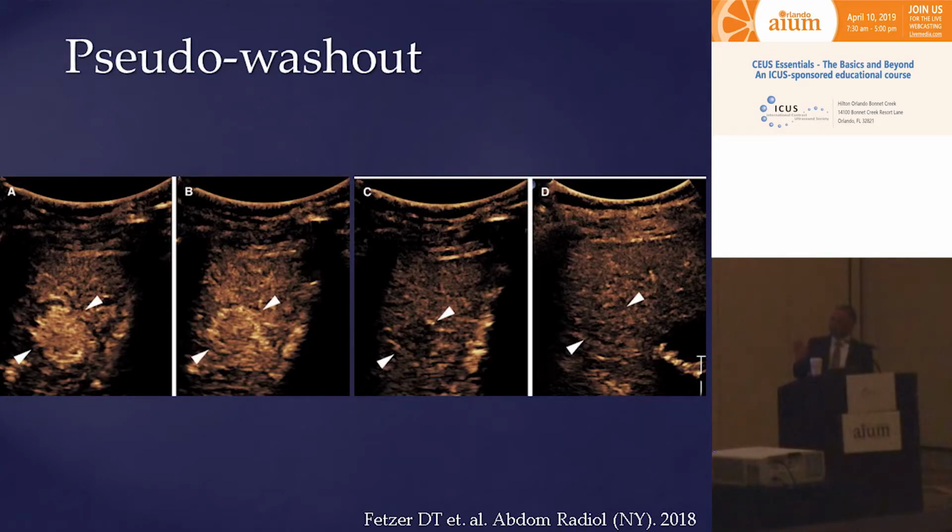And we also need to worry about pseudo-washout that happens in vascular tumors with very slow flow, like hemangiomas. If you stay on this nicely enhancing hemangioma for too long, you will break too many bubbles within it, because lots of them will be flowing at a very, very slow rate, sometimes getting stuck in the lesion in non-perfused vessels. And if you stay in the lesion for too long, you might ruin your microbubbles. The best way to avoid this artifact is to re-inject the patient and not scan until 4 to 5 minutes. Let microbubbles circulate.